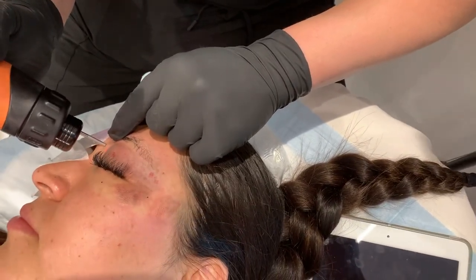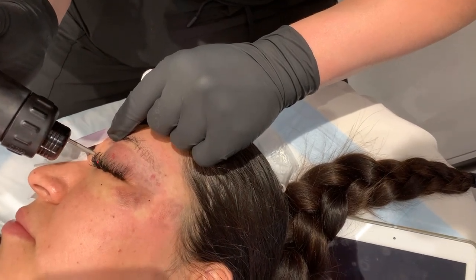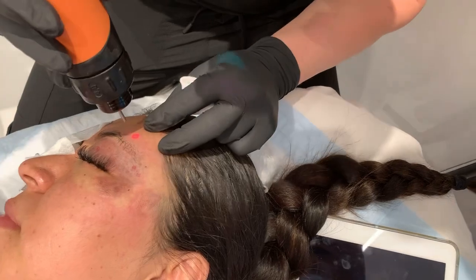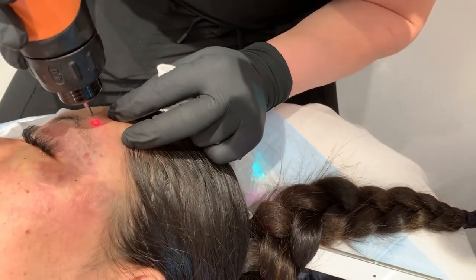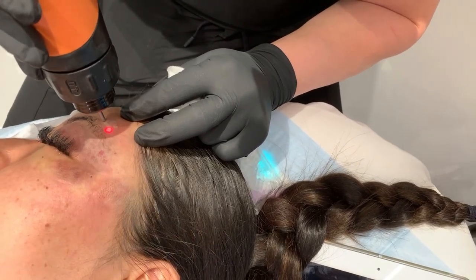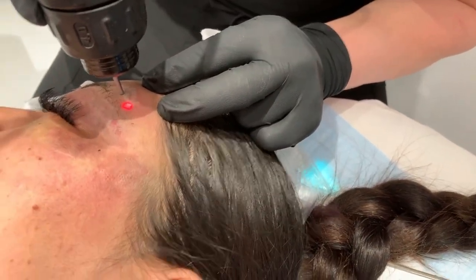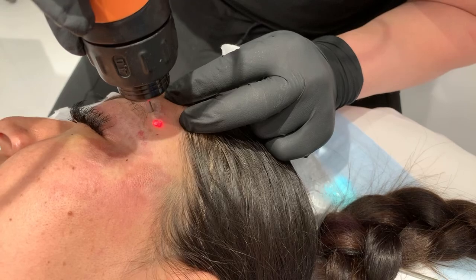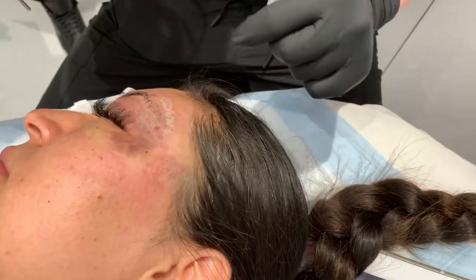Does it affect the hair on her eyebrows? It does not unless I hit it. So basically it's breaking it up and letting the collagen reheal itself. Yeah, it's breaking the particles into pieces, like taking a stone and making it into pebbles. So think of your pigment underneath as stone, and every time we hit it, it makes it into little pebbles, and then the little pebbles keep breaking apart into smaller and smaller pieces that you can't see.